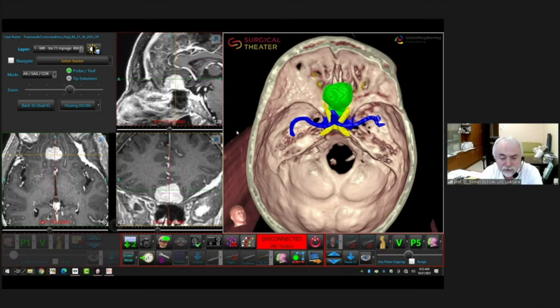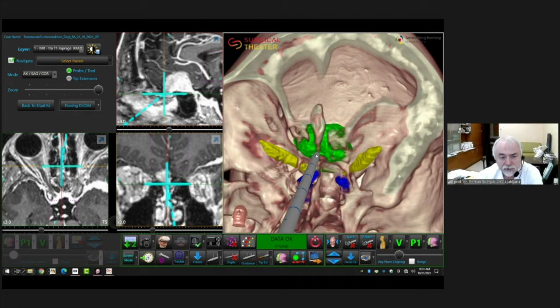Today, navigation is not just a targeting tool — it also enables so-called augmented 3D reality. This virtual reality makes all structures more apparent; they are segmented, and this helps our work around the tumor. Here we are using navigation with augmented virtual reality for removal of a tuberculum sellae meningioma.